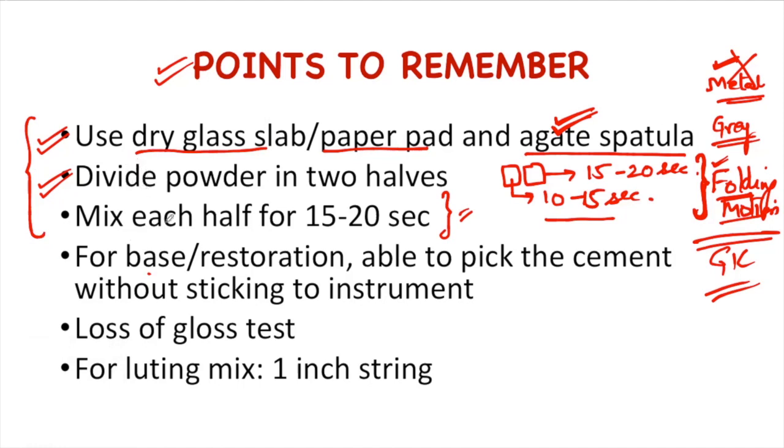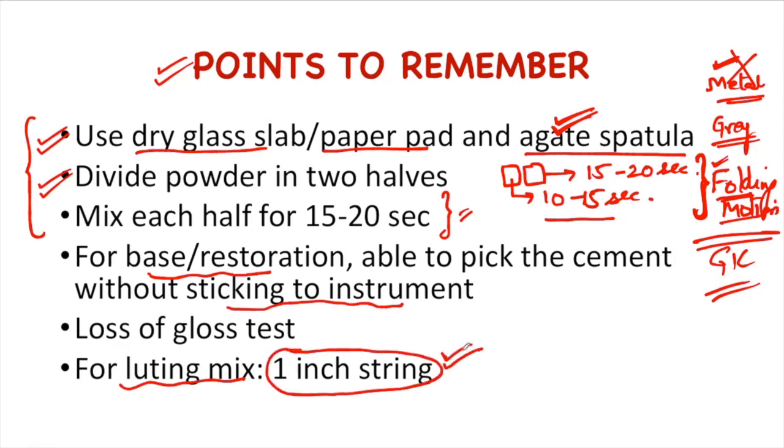Let's see the ideal consistency of mix for base or restoration and for luting purpose. If GIC is to be used for base or restoration, we should be able to pick the cement without it sticking to the instrument. If we are mixing it for luting, a one-inch string consistency should be present — that means a one-inch string should be formed when the flat surface of the spatula is pulled from the mixed cement. This is the ideal consistency for GIC used as a luting cement.